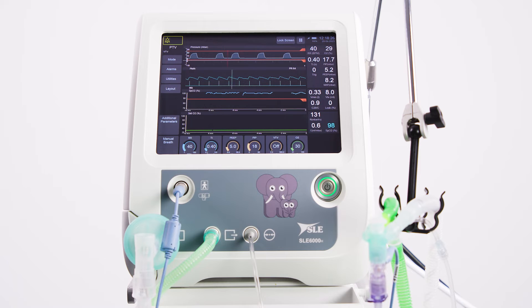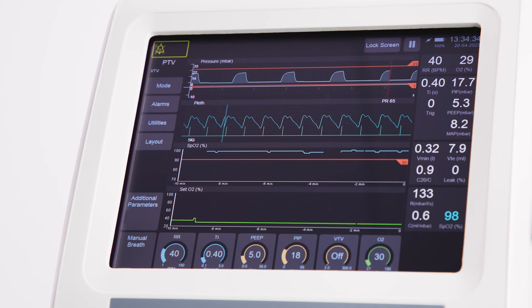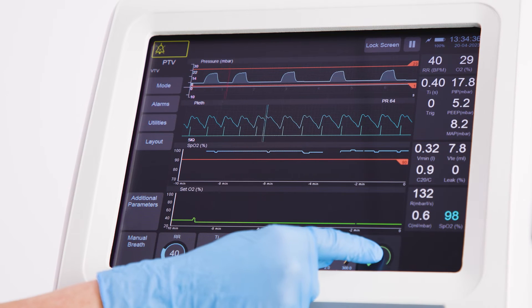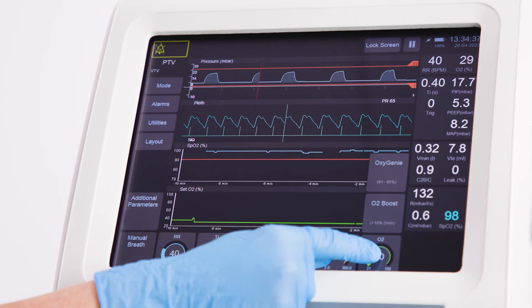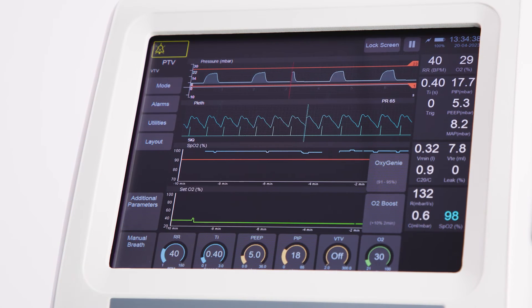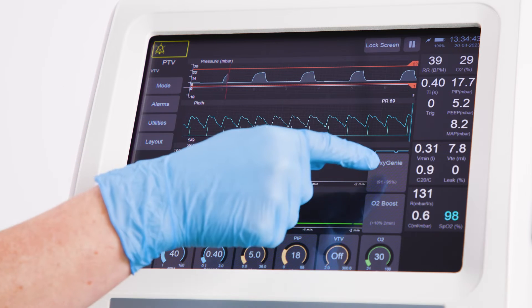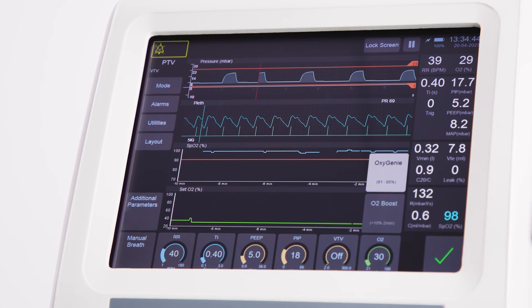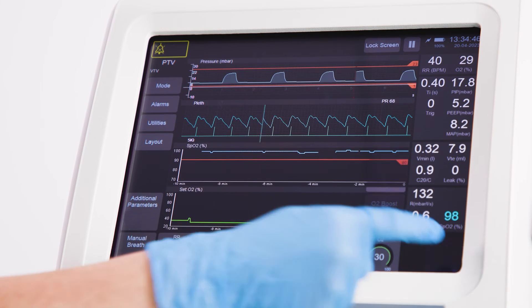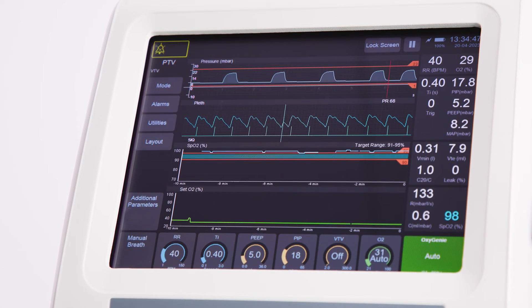Once a stable SpO2 reading is achieved, the user can then activate Oxygeni by pushing and holding the O2 control until an extra button appears above the O2 control. The user should then press this button to turn Oxygeni on and press Confirm to activate the mode.